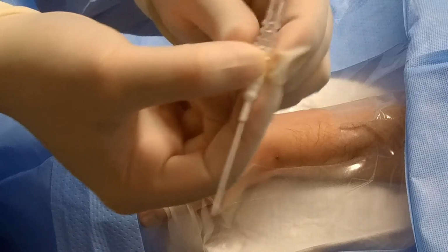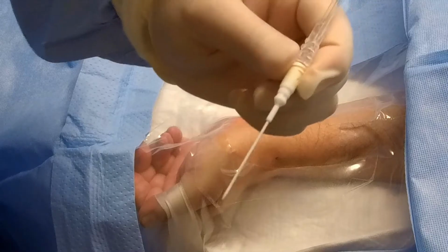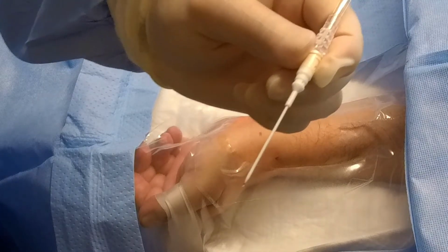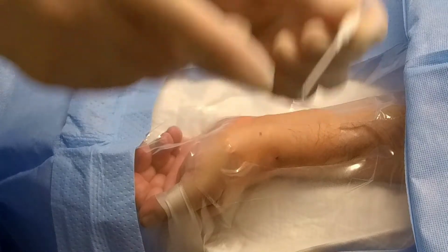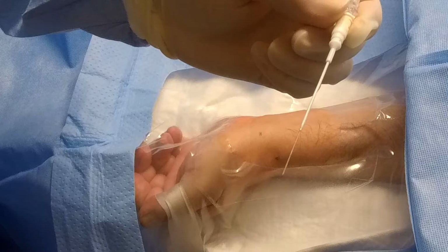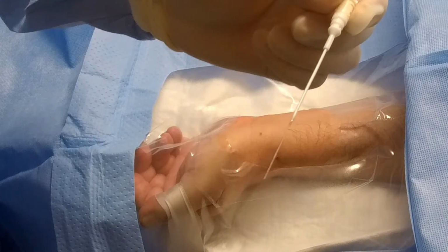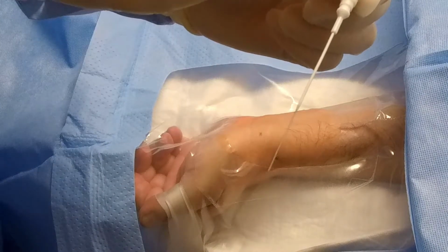That means your blood flow was up. This is your guide wire. Once you hit the artery, then you should have a good, nice flow. And you put your guide wire in. Once you hit that black line, your guide wire should be showing outside this catheter right here. I would rather push it beyond that black line so you know your guide wire is in the artery before you start to push the catheter in.